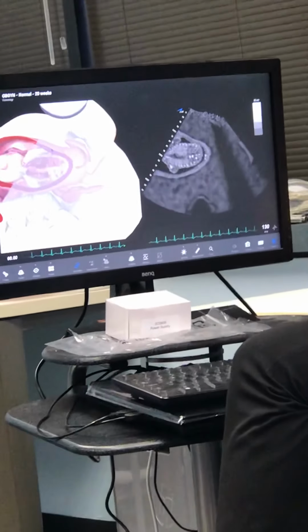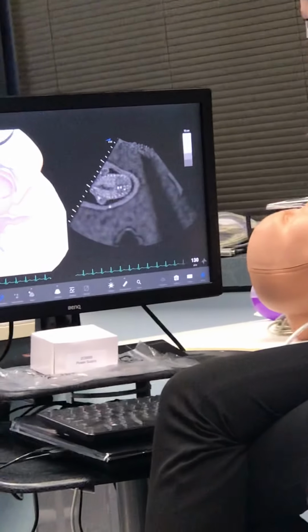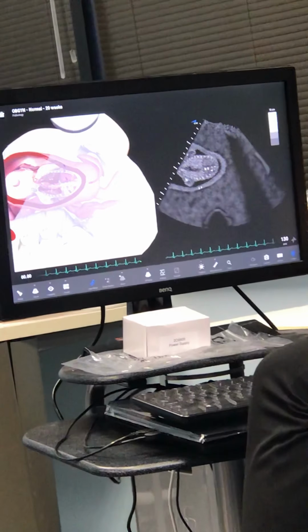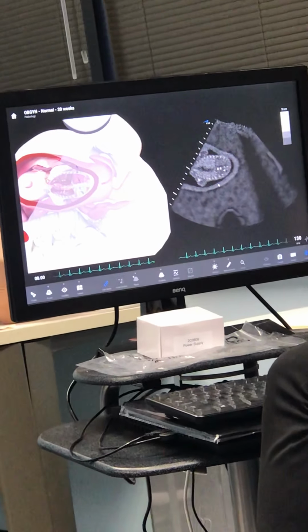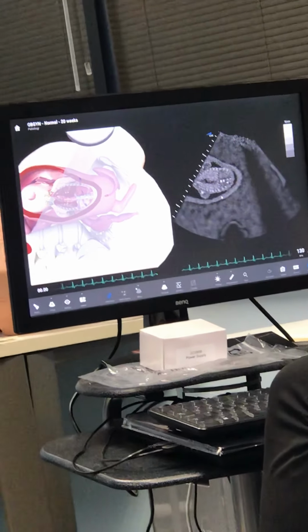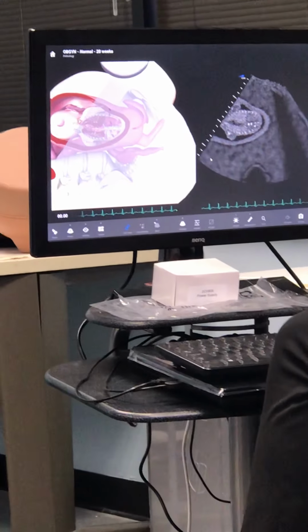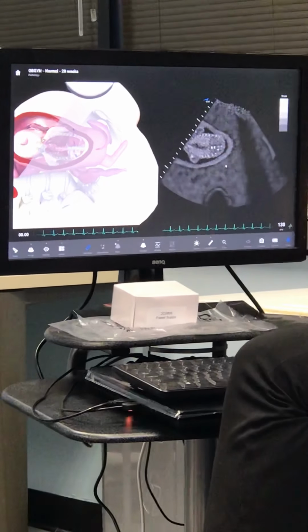I feel like that one's a little bit bigger, although this one will be easier to measure. Yeah. So you just measure till the baby. You're just measuring the black part. Okay. Don't cut through baby. But if you can cut through baby because they're not being seen, or even if they're seen, you know, like in between the neck and the little arms, there was like a pocket. That's too high up for that. You're wanting to stick to whichever lower piece you're on. Oh, okay. Does that make sense?